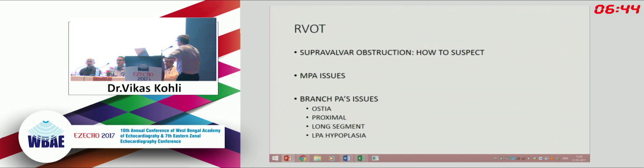Just as in the previous two pictures, if there is a thick whitish ridge just at the place where the pulmonary valve is doming, there is a supravalvular area, and plus there is visible narrowing of the supravalvular area compared to the pulmonary valve annulus and the sinus, then we are sure that there is a supravalvular obstruction in addition. That is the main diagnosis by echocardiography, and also in cardiac catheterization it can be substantiated.